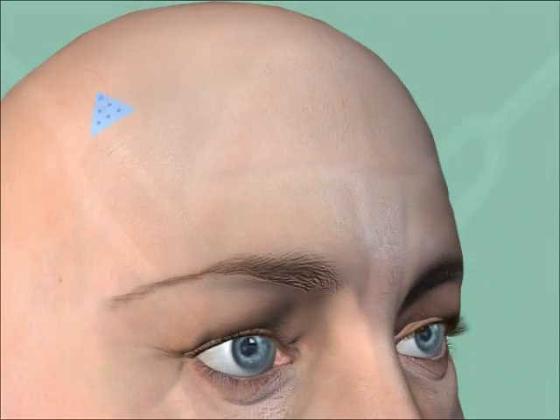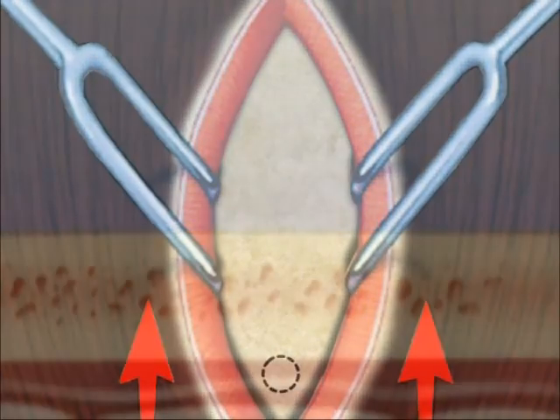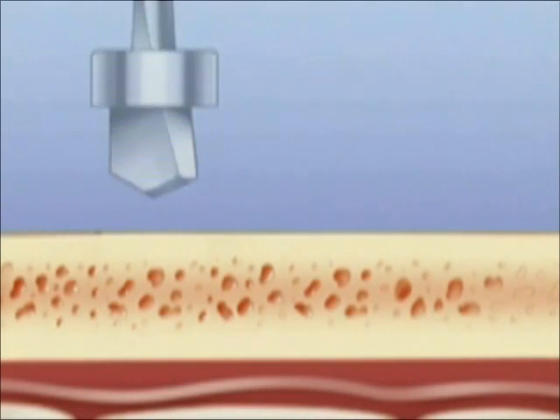After the section of the muscle, we can fix the elevation of the forehead with the Endotine system of Coapt, a coat rack system locked in a bony hole.